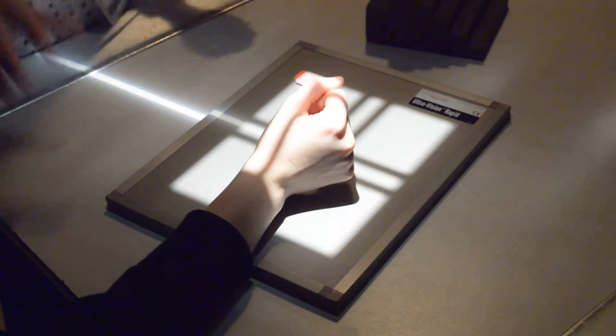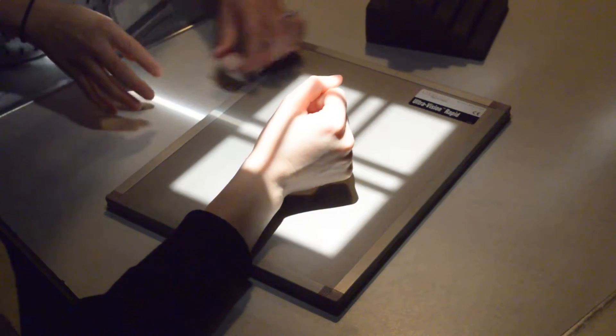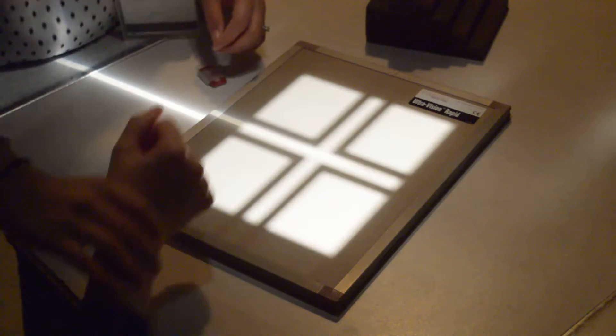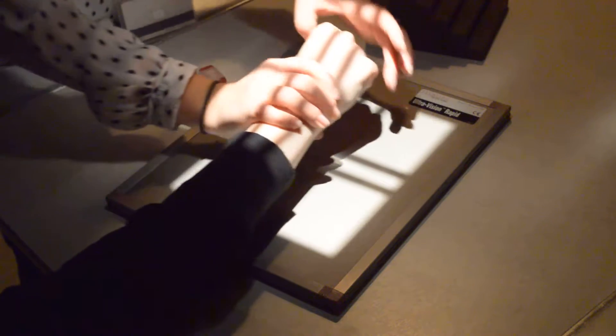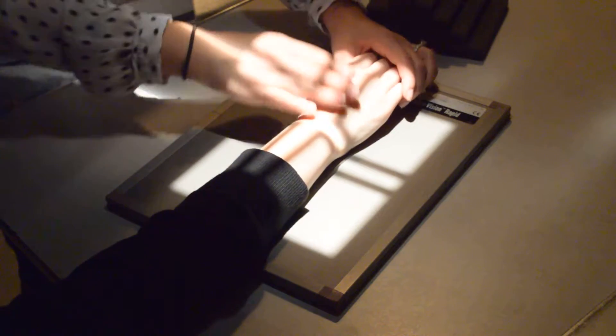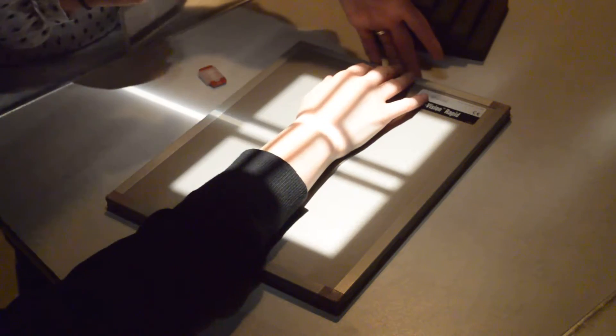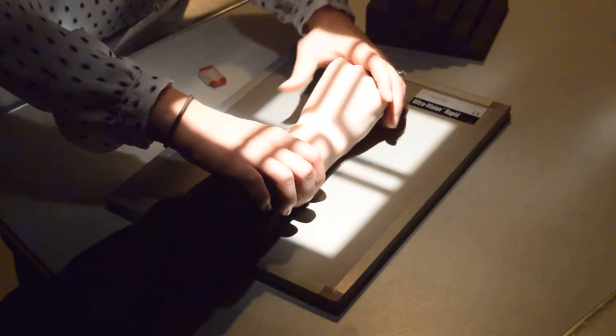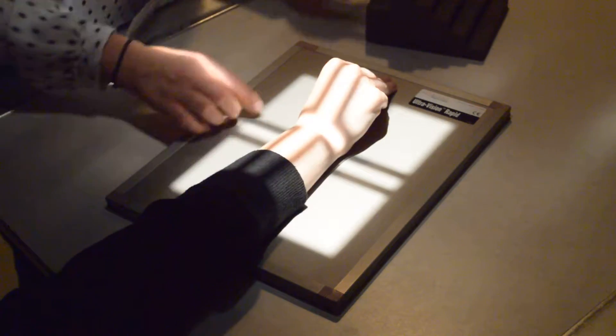Okay, so now we're going to go on and we're going to do a PA wrist. So when we do a PA wrist, what you want to do is you either want to have your patient form a fist with their hand, you can have them grasp onto the edge of the IR. We're just going to have Libby make a fist.